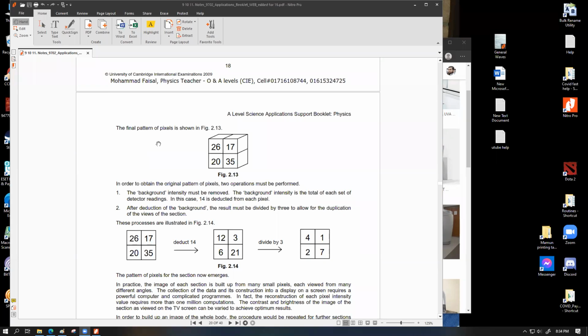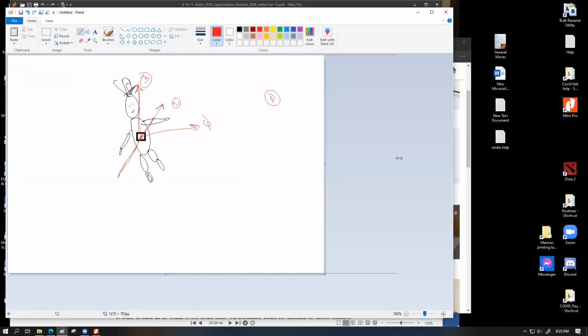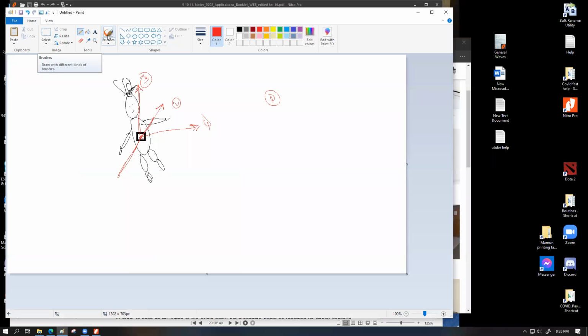All right. And eventually the calculation will become much too big and difficult. Here we are working with only 4 voxels. That's why it is, at least to some extent, understandable how this works. The moment you go for a bigger number of voxel values, you're going to end up with a much bigger amount of numbers. For example, if we simply want to take a 3 by 3 box, try to understand the amount of complexity that we're going to have to handle.